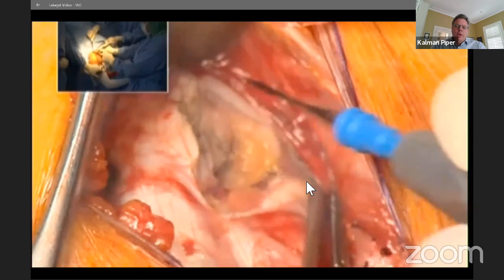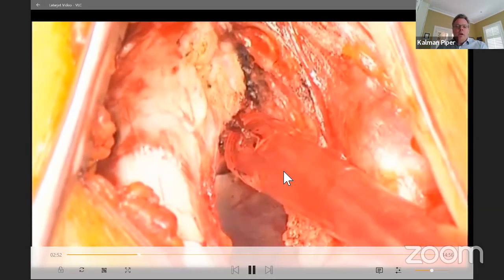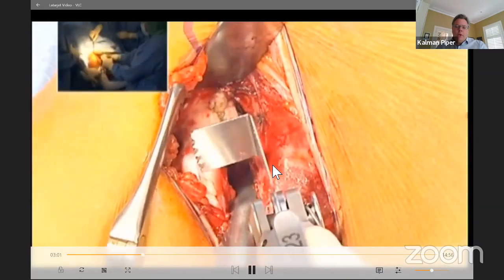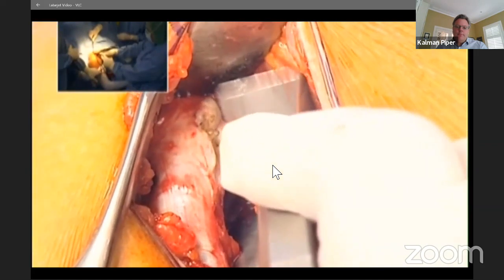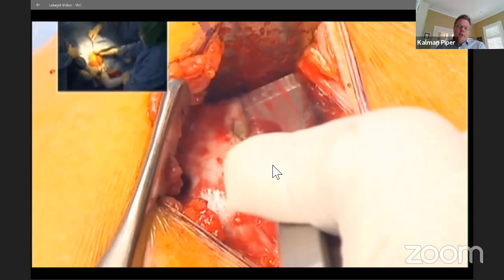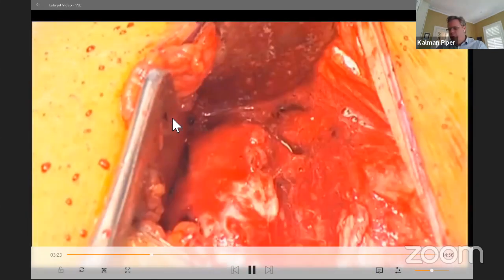The pec minor muscle comes straight off the bone, taking care. The musculocutaneous nerve is not too far away. I leave some of the soft tissues attached, particularly laterally, because of the blood supply to the coracoid process. And then a right angle blade is used from the medial side to the lateral side to help protect the brachial plexus. And you're aiming to cut the coracoid process about 2 centimeters from the tip, or at the angle of the coracoid process. So once it's removed, just showing here the location of the musculocutaneous nerve.